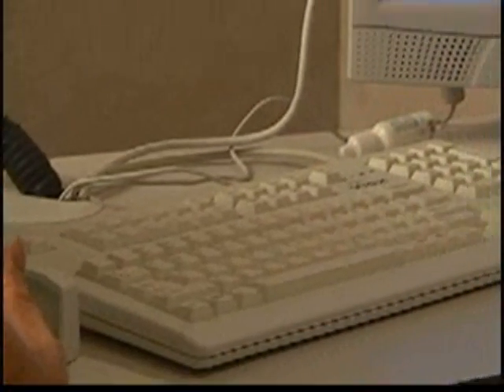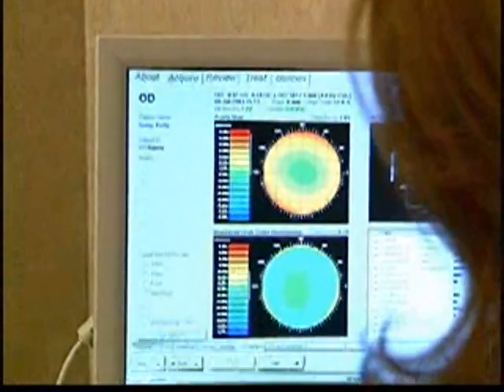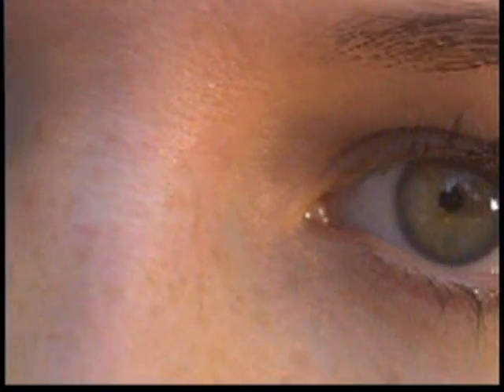To create the treatment plan, your visual fingerprint is compared to an ideal wavefront map, and the computer designs a personalized treatment plan that is specific to your own visual needs. Wavefront technology is therefore groundbreaking because it has the potential to improve not only how much one can see in terms of visual testing on the eye chart, but also how well one can see in terms of visual quality. Treatment of visual nuances should translate into a reduced risk of post-LASIK side effects, such as glare, halos, and difficulty with night vision. And this is exactly what happened.